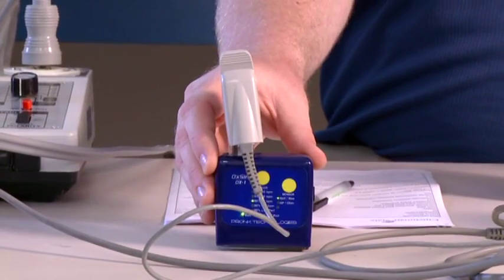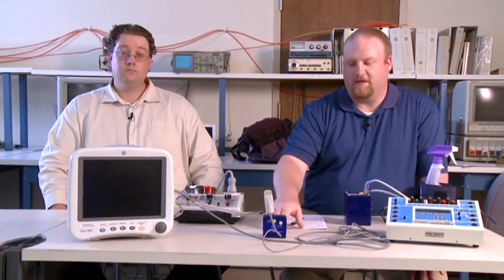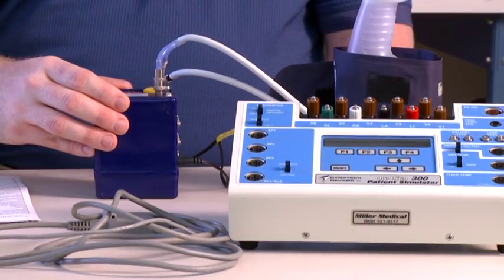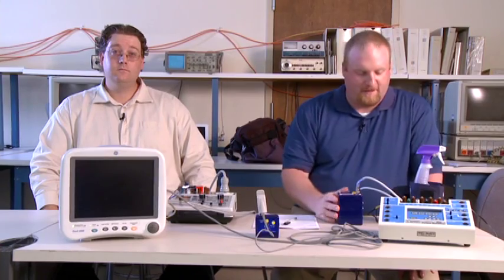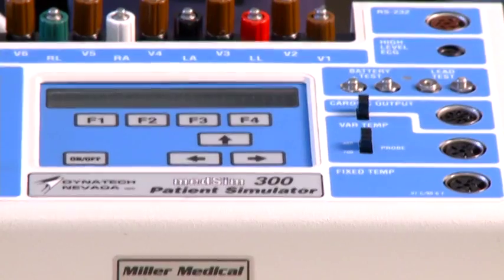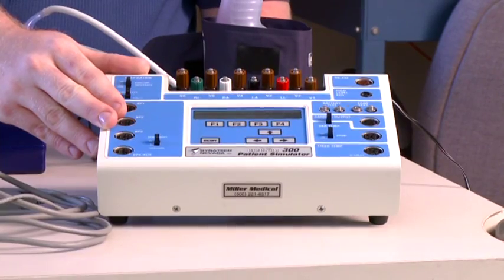This right here is a SpO2 simulator. It is basically the oxygen content in your blood. And here we have a blood pressure monitor simulator, which you're supposed to have maybe something better in the bottle, but we use what we can here to simulate an arm. And here's another patient simulator. It is going to be used for ECG and respirations per minute.